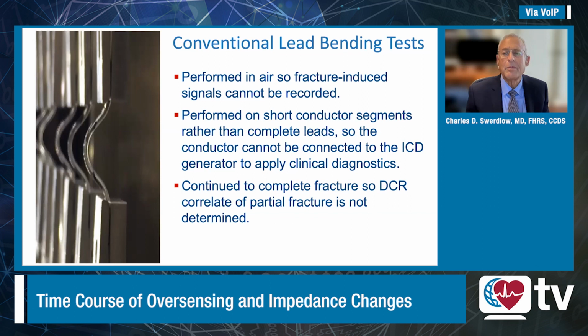Yeah, thank you, Marye. So first, let me briefly address why we didn't actually know the answers to these questions after using diagnostics for so many years. And the answer to that lies in how leads, how conductors are tested preclinically.